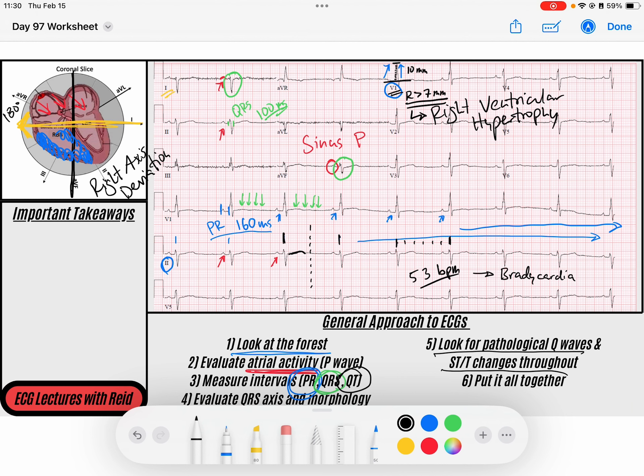And so when we put this together, what do we have? We've got a sinus rhythm, specifically a sinus bradycardia at a rate of 53 beats per minute with right ventricular hypertrophy causing right axis deviation.